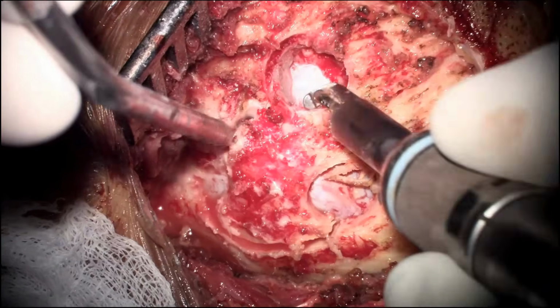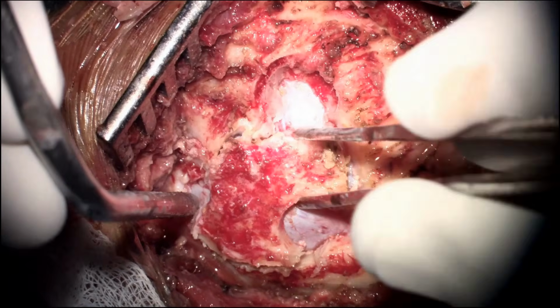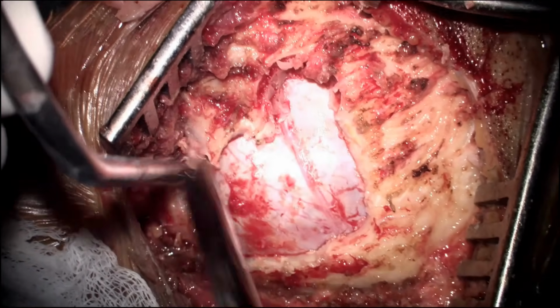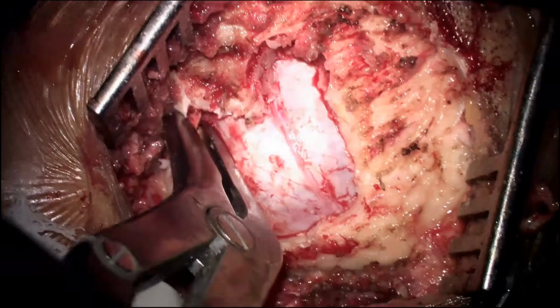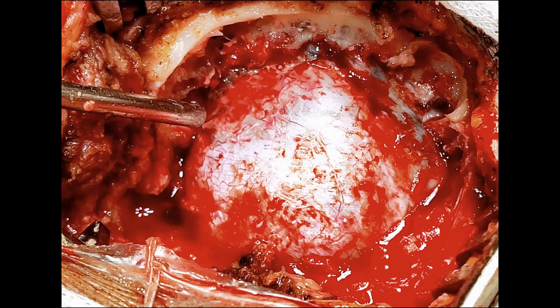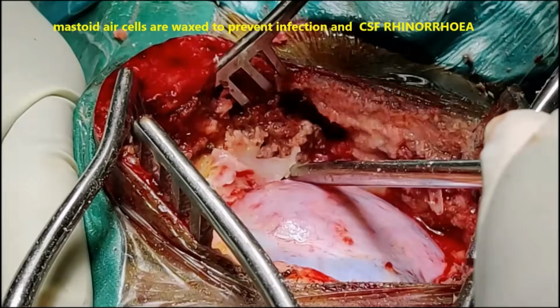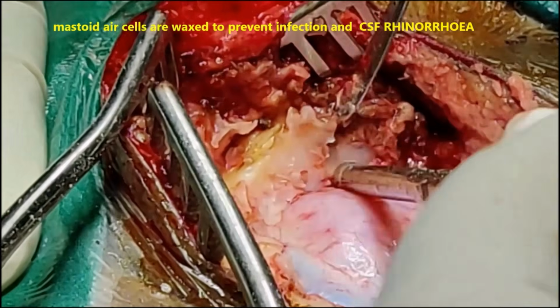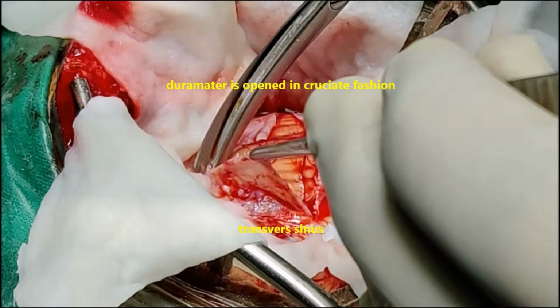Superiorly, the craniotomy goes up to the transverse sinus, inferiorly up to the foramen magnum, medially up to the midline, and laterally up to the sigmoid sinus. The bone flap is elevated, a free bone flap. The bone is nibbled laterally up to the sigmoid sinus. Once that is done, we drill the mastoid laterally till we expose the sigmoid sinus laterally and the transverse sinus superiorly. The mastoid air cells which are exposed during the drilling are waxed well to prevent subsequent CSF leak.